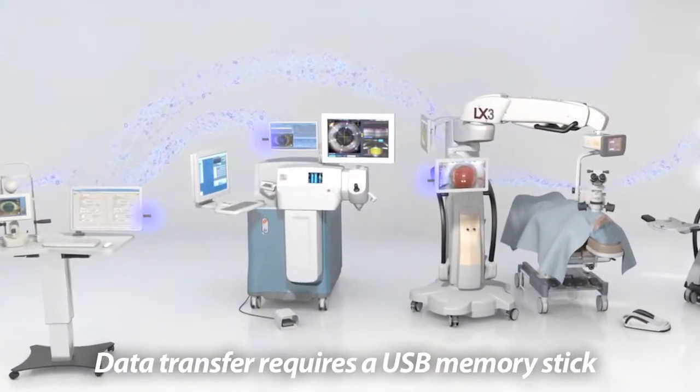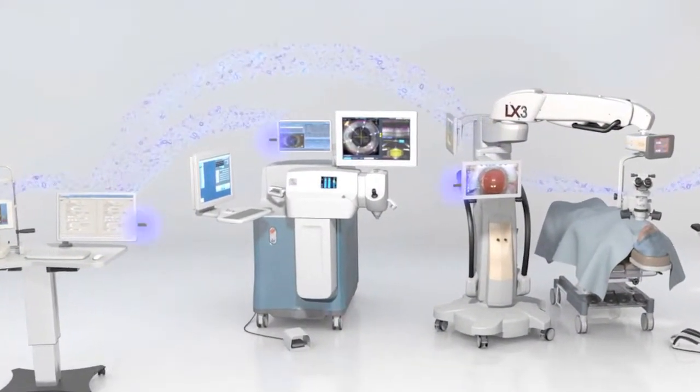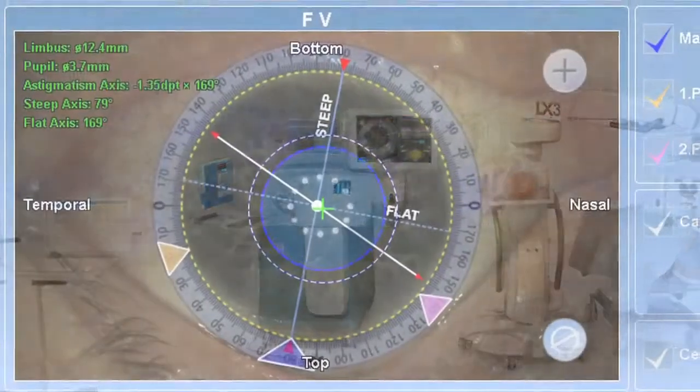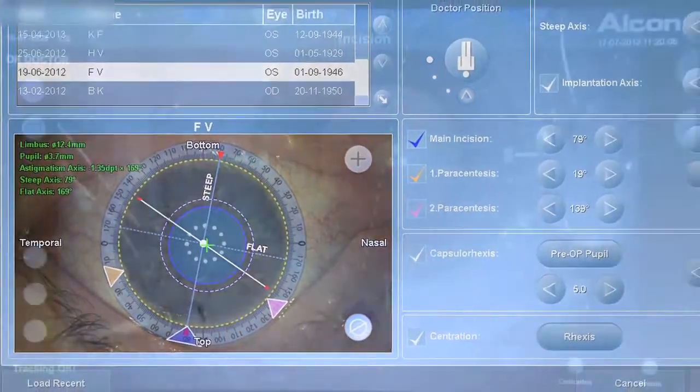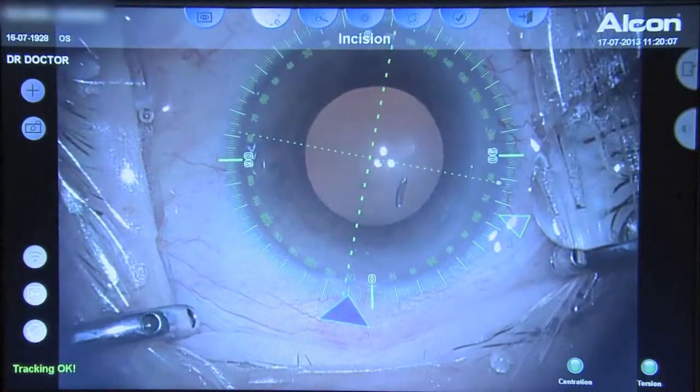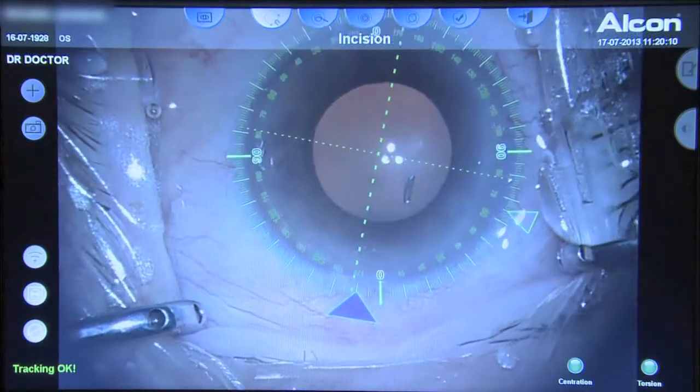During the execution phase of the procedure, using the reference image as a fingerprint, the Veryon digital marker allows surgeons to position all incisions and alignment in real time while accounting for the variable impact of cyclo rotation.